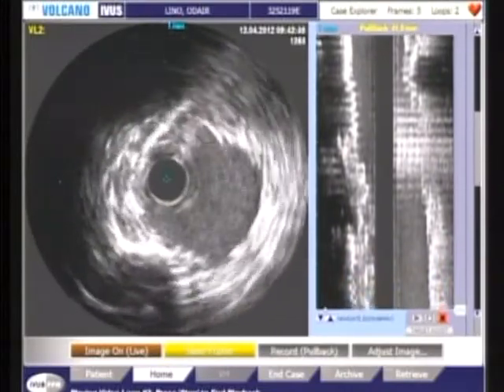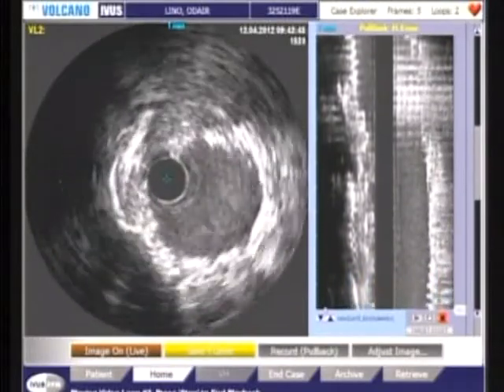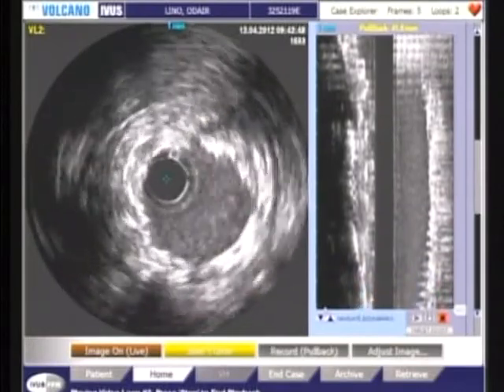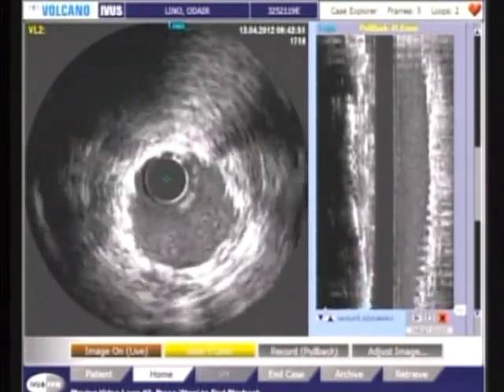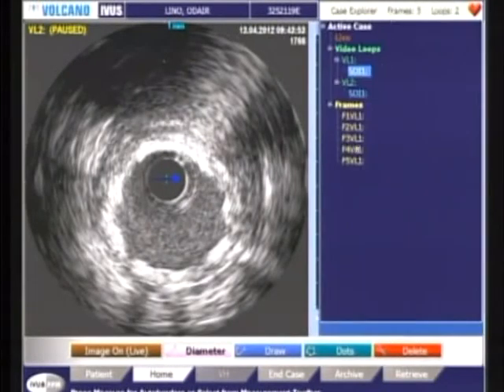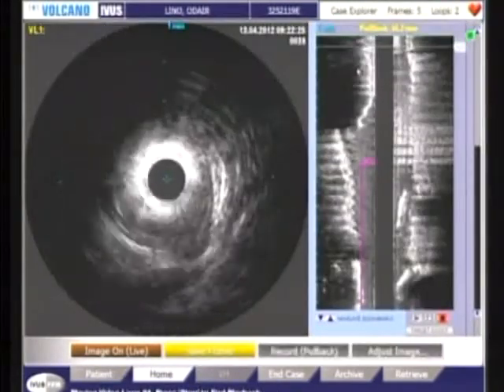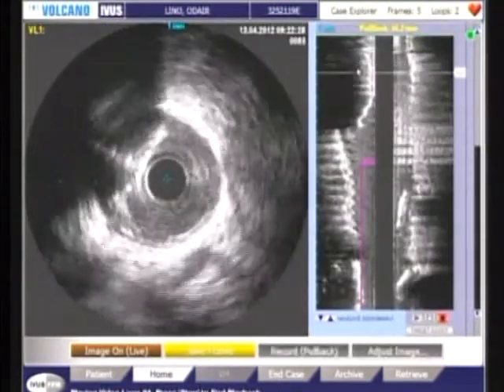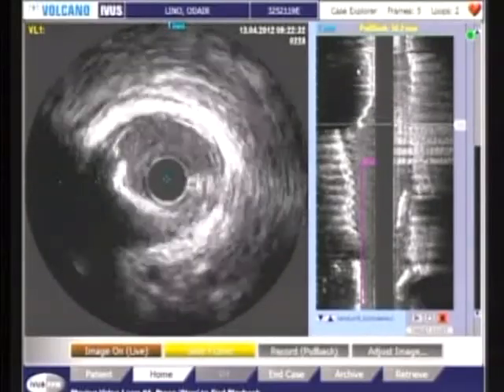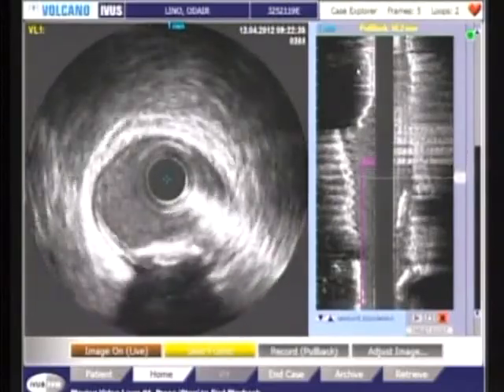Can you have the IVUS there? Yes. Can you go ahead and describe it? There is nothing there. No intimal hyperplasia so far, and a very good lumen. That's the final, right? You see here the baseline, actually. We started very early here today, Alex. It looked so good, there's no in-stent restenosis there. That's good. Pedro is using the Volcano.